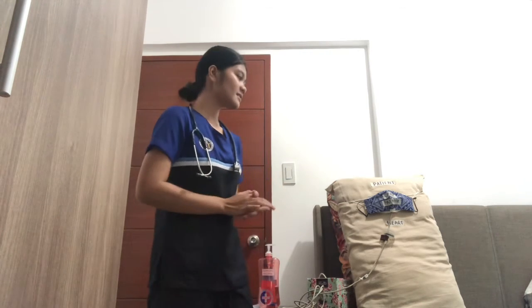Very good. So, in the middle of the administration, you should encourage the patient to do several deep breaths and facilitate coughing techniques.